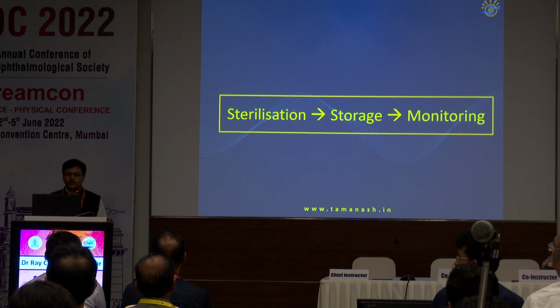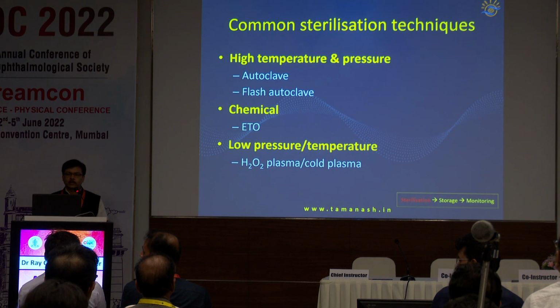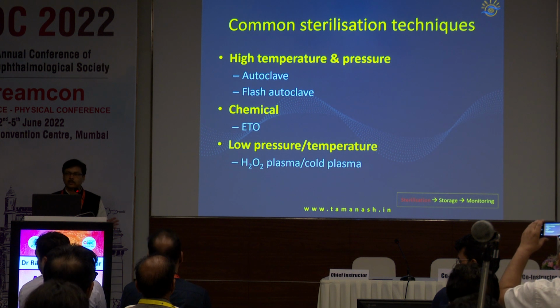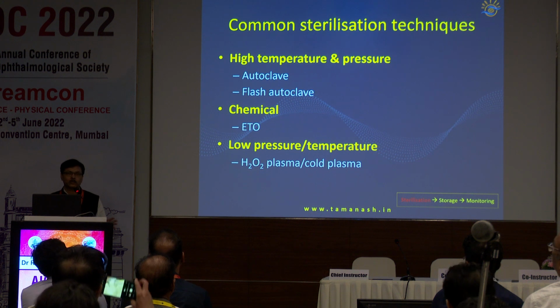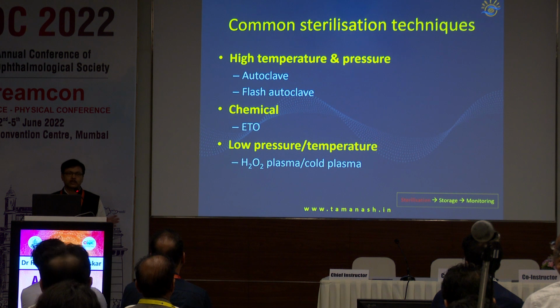Okay, so the rest of the talk will be on sterilization, storage, and monitoring. The most common sterilization techniques that we use are steam under pressure. So that is temperature and pressure, that is autoclave. And we have something called a flash autoclave, which actually gives us a lot of mental peace, but it is not really that great, as I will tell you.